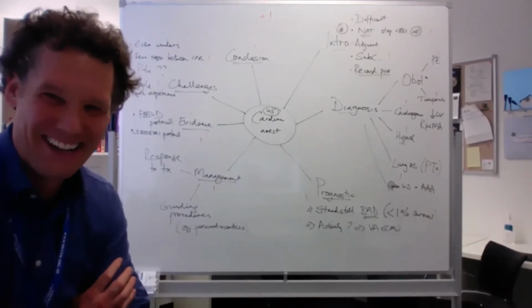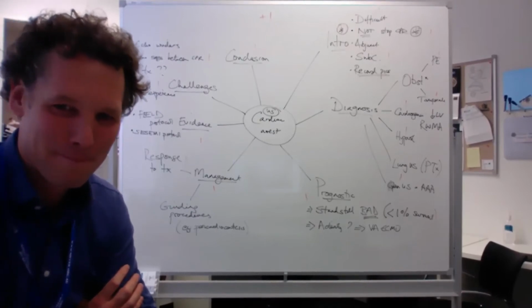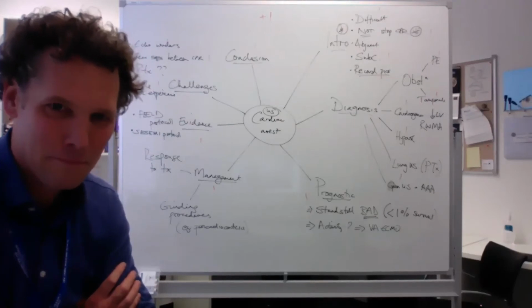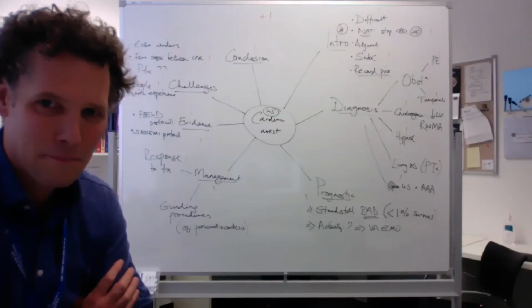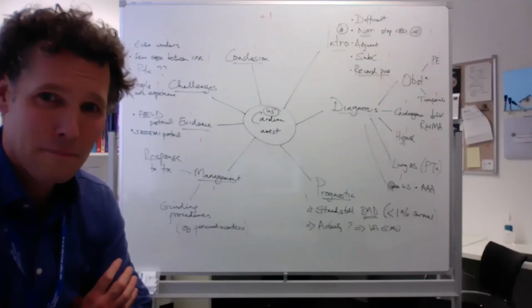Yeah, exactly. It's beautiful. I would say we tend to think of the advantage of echo during cardiac arrest for H's and T's, trying to work out a differential, and then to guide a procedure if there is a procedure such as a pericardiocentesis. But actually, the really big advantage is that it helps us with rhythm identification. There's a very serious error rate, a misdiagnosis of asystole, when often it's fine V fib leading to a shockable rhythm.